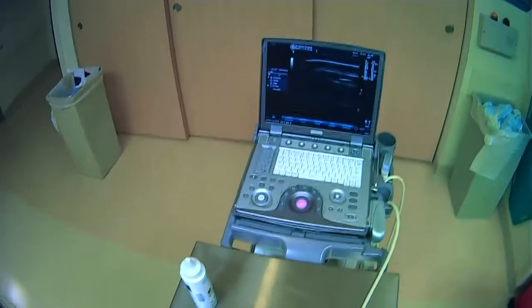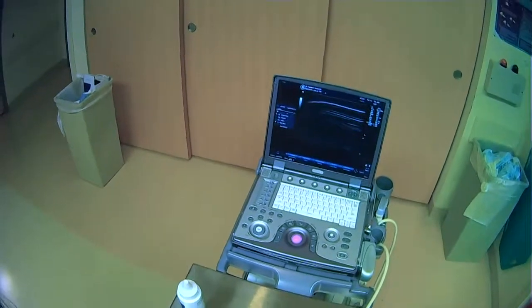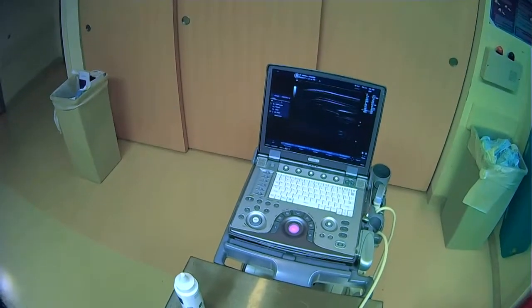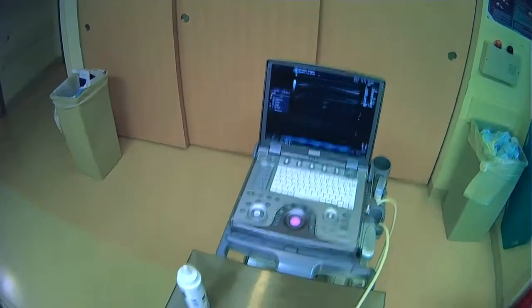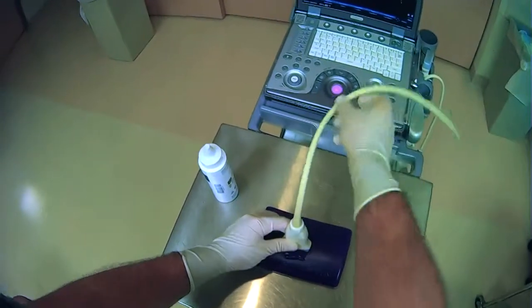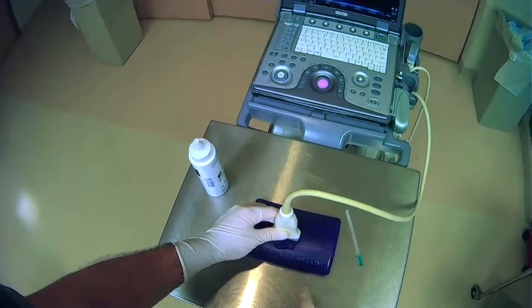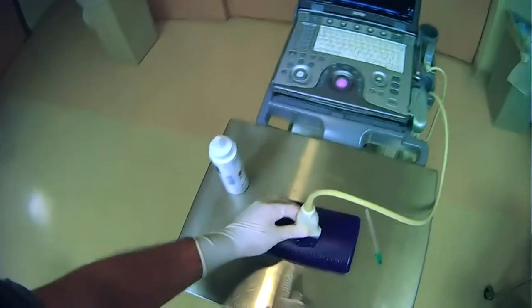Always good to test the probe before you start, so you keep in mind your orientation. When you're on your work surface, you can lift the probe one direction or another and start to see where things are aligned. We're working in this axis right now, which is pretty intuitive — the right side here is the right side of the screen, and the left side here is the left side of the screen.